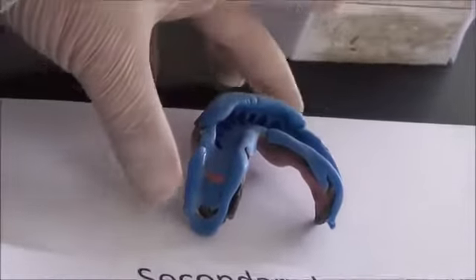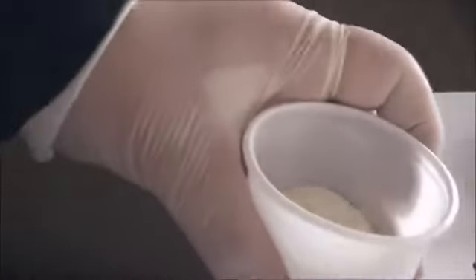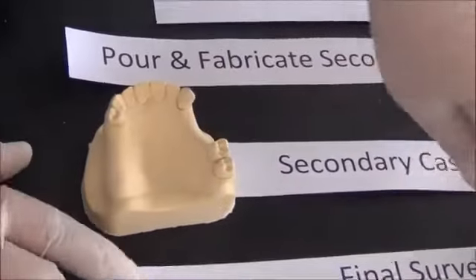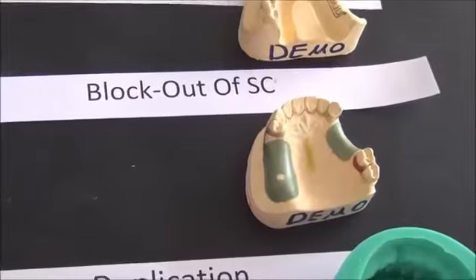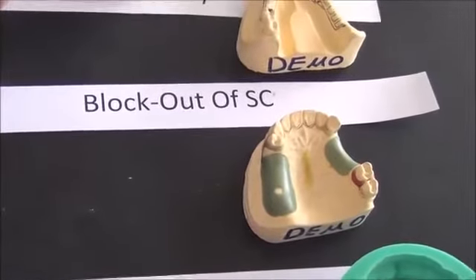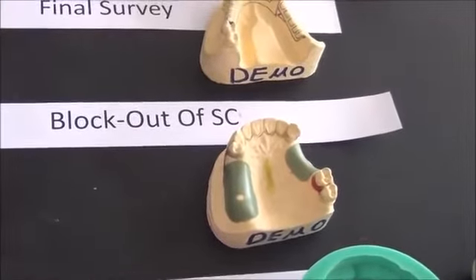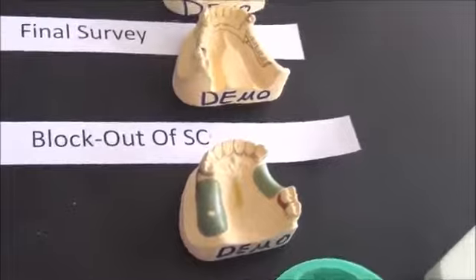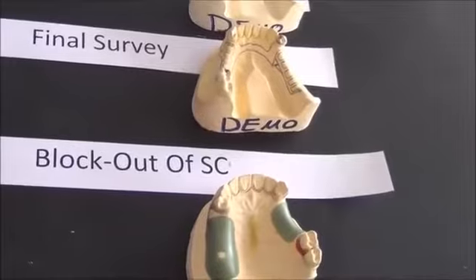This secondary impression is poured using stone. The technician will then have the secondary cast ready. He is going to draw the final survey exactly as present in the authorization form. So the technician will do a blockout of the secondary cast. The blockout procedure will be described in further detail later, but the idea is to prepare the cast in a way that would follow the principles of metal framework design. So we need to do what we call a duplication.